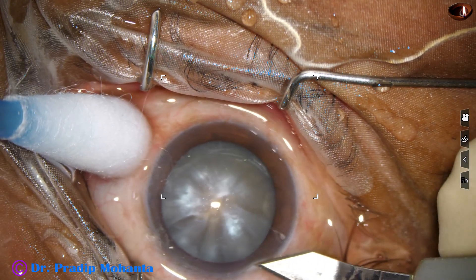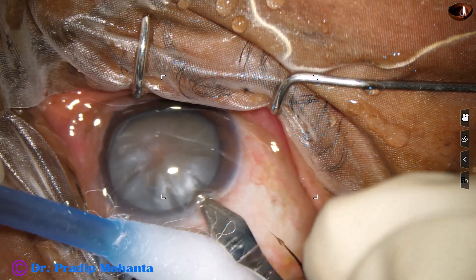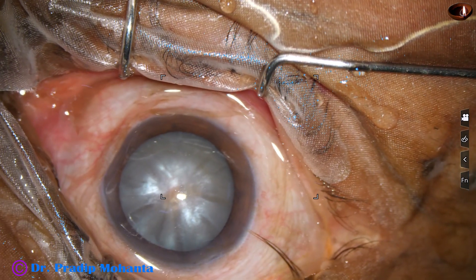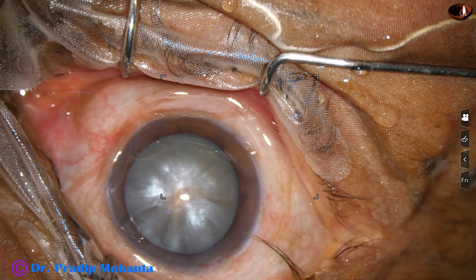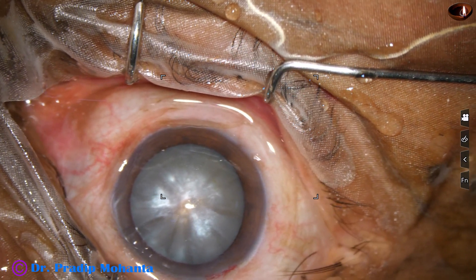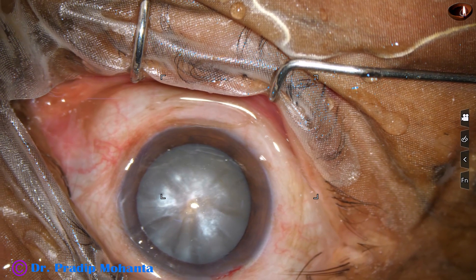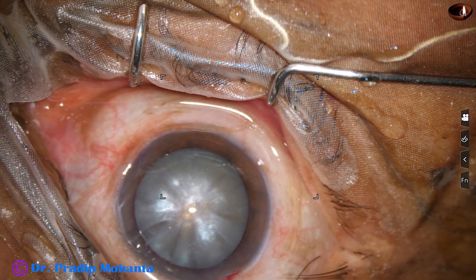This is the main incision with a 2.8 millimeter steel keratome at mid-limbus at around 11 o'clock. We can see some eyelashes exposed, not covered by the drape. So we take a scissor, trim these eyelashes, and wash them away from the operating field.